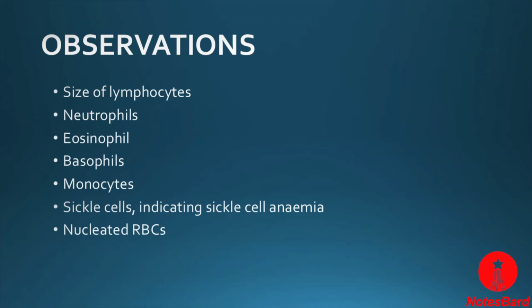Now the blood smear test also gives some findings related to the CBC, including the red blood cell count. The degree of color of these RBCs matters: hyperchromic cells, and light red cells referred to as hypochromic, indicate iron deficiency anemia in the patient.